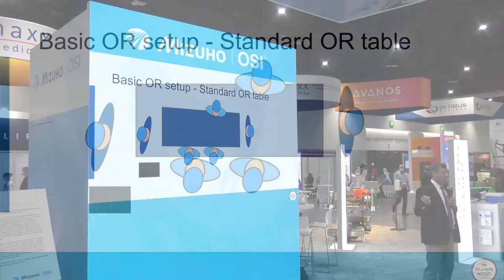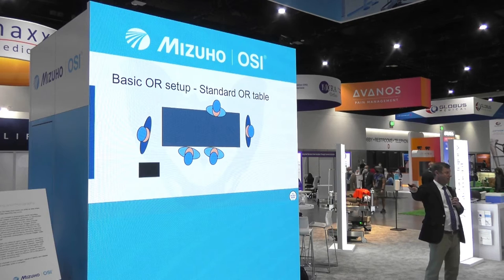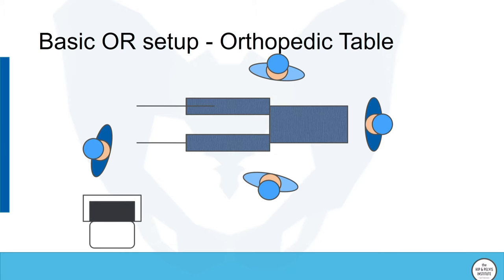So the basic setup, if you're not going to use a Hana table and you're going to use a standard OR, you're typically going to have your anesthesiologist at the top, your circulator at the bottom of the table. On one side, you'll have a surgical assistant who's going to hold retractor for you. You're going to have yourself as the surgeon here at the bottom, and you're probably going to have somebody there to help hold the leg. Okay? You can eliminate that person holding the leg by going very easily to the orthopedic table.